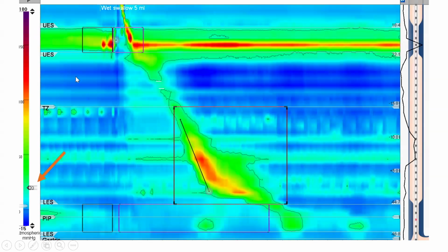But where do you see the number here? Unfortunately, this is a screenshot, but usually in the software you can see it at the bottom. For the viewer, you cannot really tell from the reading, but we can tell from experience. So this is normal. In general, anybody doing this should adjust the borders and lines, and look at what you get at the bottom of the screen. Okay, please go ahead.